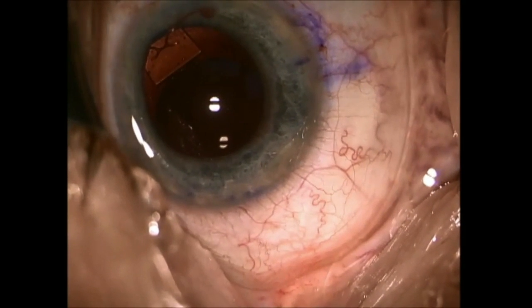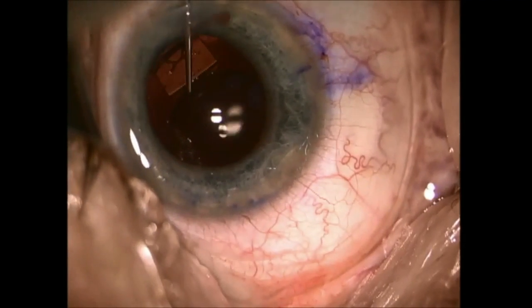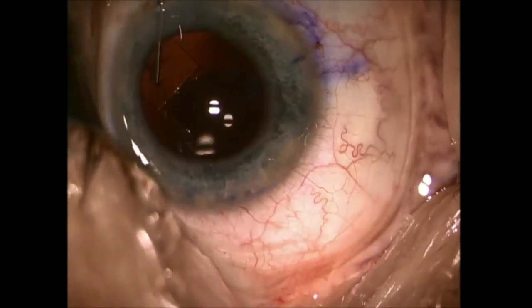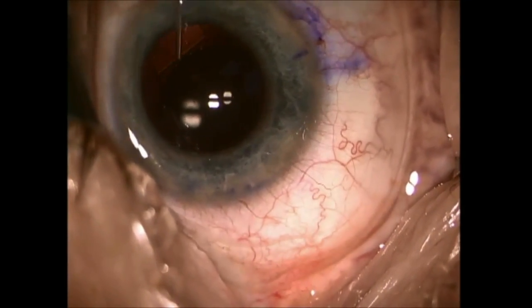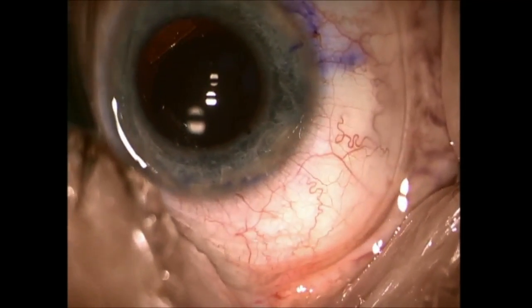So you have to make sure the leading haptic, the orange ball, is round to the right. And then you place the trailing haptics in and make sure that both orange circles are tucked into the capsular bag.